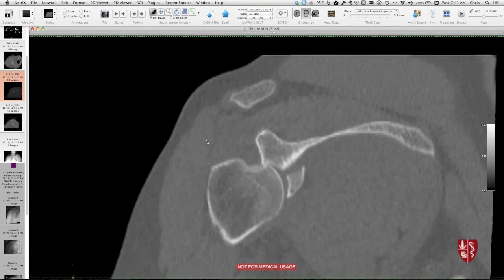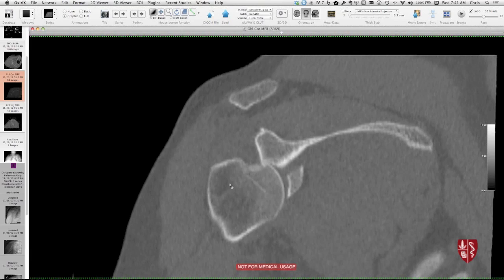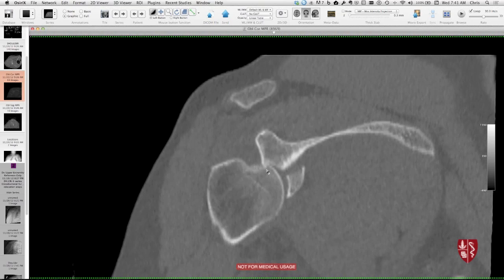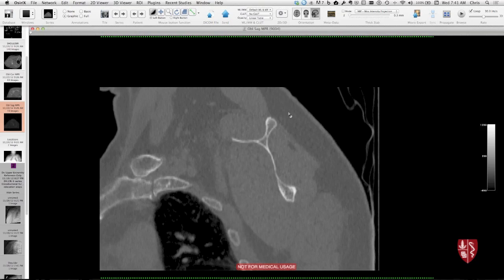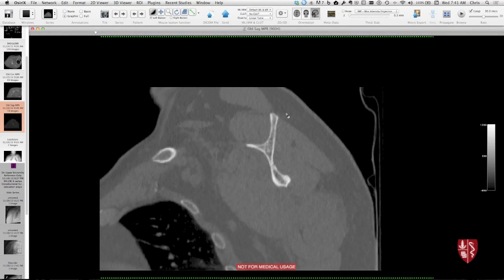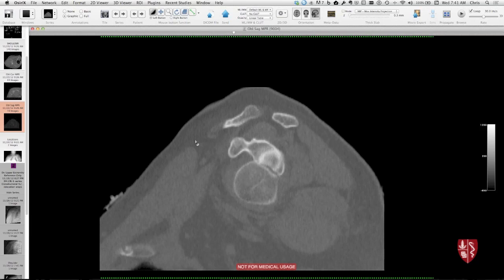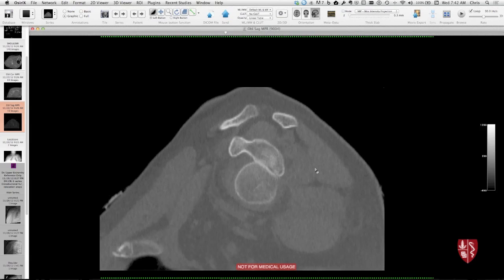What the surgeons want to know is whether there's a major fracture of the humeral head, whether there's a bony glenoid fracture, and if there is, whether that fracture is big enough to put back with screws — because they need to try to restore anatomic congruity of the glenoid to get the shoulder stable again. The sagittal views are also helpful. Here's an oblique sagittal just in the plane of the glenoid — here's anterior, posterior, here's the coracoid process, and the humeral head is dislocated inferiorly.